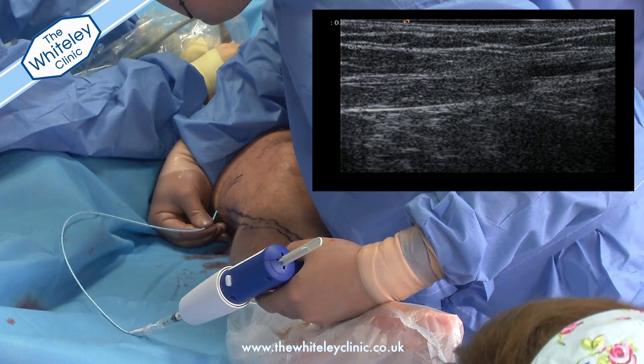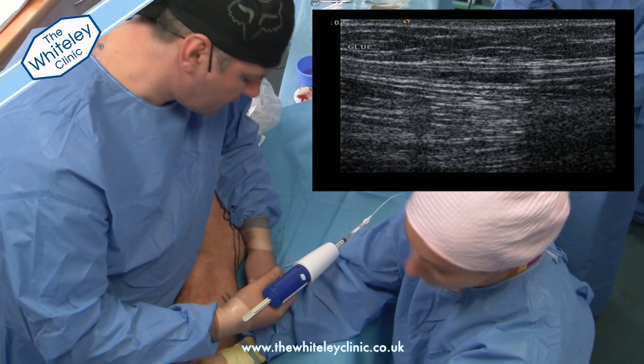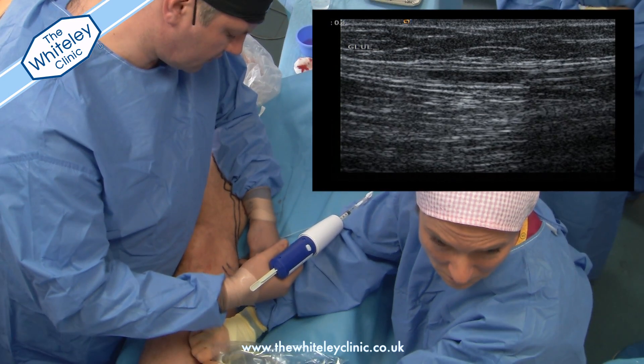We then move the whole assembly back just one centimetre and pass some more glue into the lumen of the vein. We then wait three minutes for the glue to polymerise, which means to really harden and make sure it's completely stuck together.